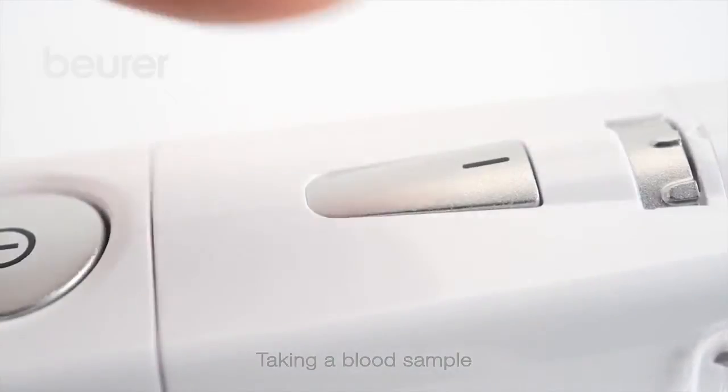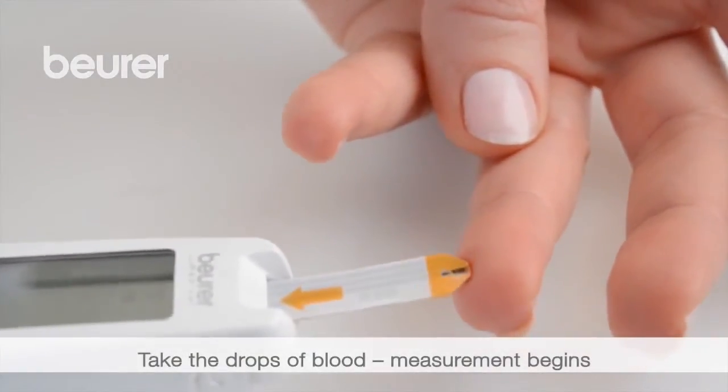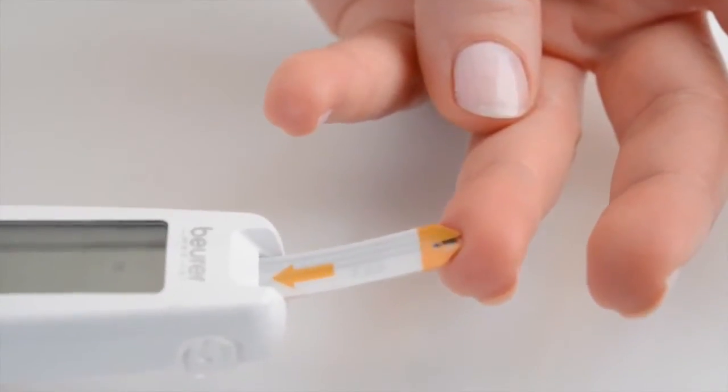Position the lancing device and press the trigger. Completely fill the input gap with the drops of blood. The device begins counting down.